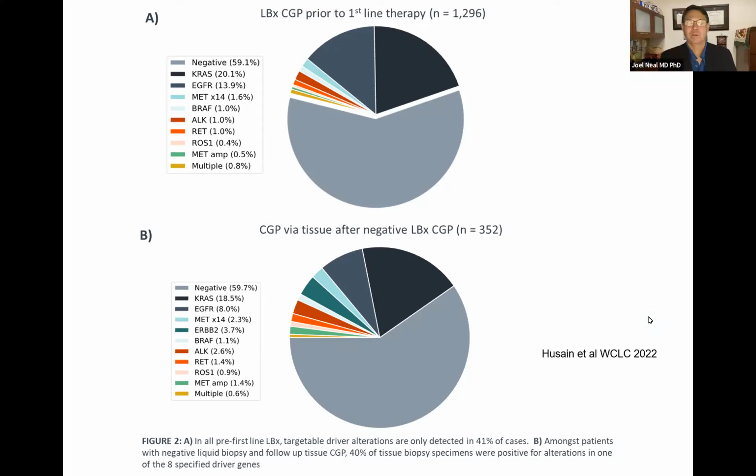a little more clarity. Well, if your tumor fraction percentage certainty was 99.9%, maybe we could write that in as eligibility for a ctDNA test, right? Yep. Really important points. All right. Well, thank you guys. I think we covered a very important concept, which is concordance, really thinking through how do we evaluate the utility of a plasma result.